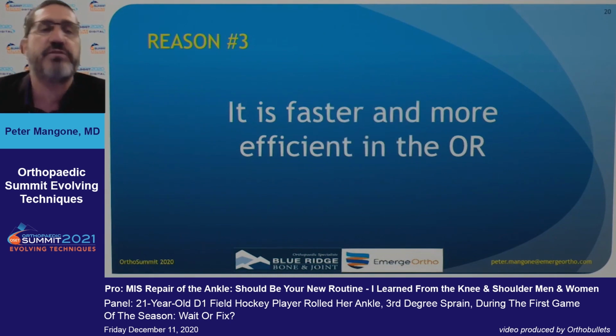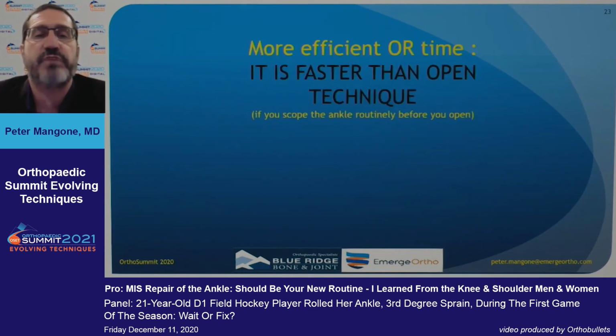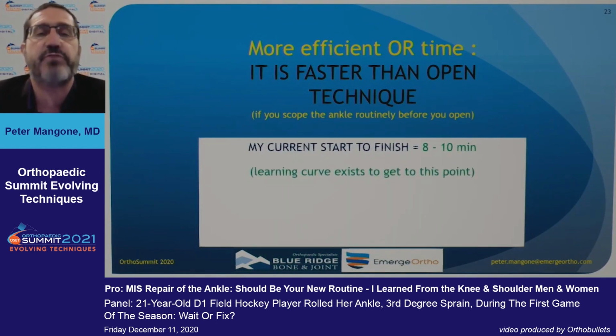The third reason to do it, it's faster and more efficient in the operating room. Open ligament reconstruction takes time, whether you're reprepping and draping or you're taking down the leg from the leg holder. You have increased OR time, water extravasation. Frankly, I can do this procedure in about 8 to 10 minutes. And so after I've scoped the ankle, it takes me about 8 minutes to do my procedure.